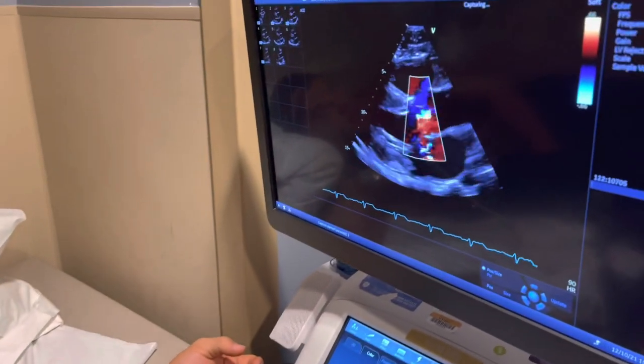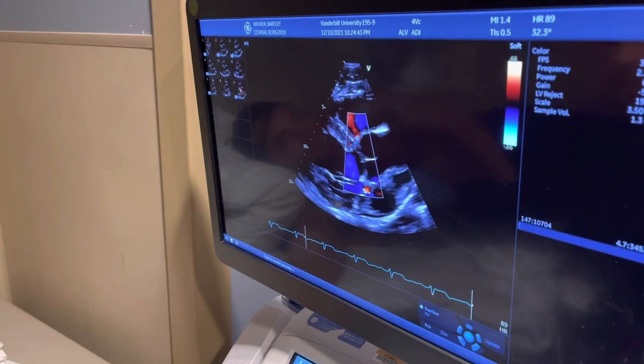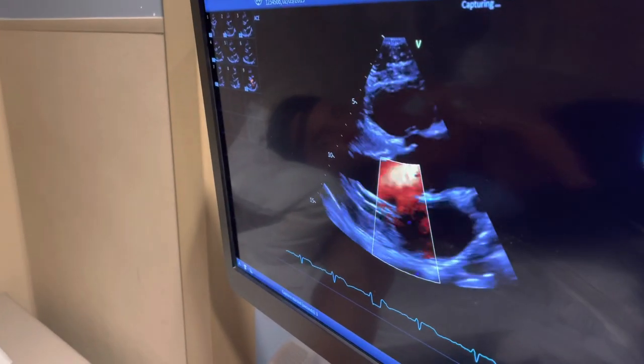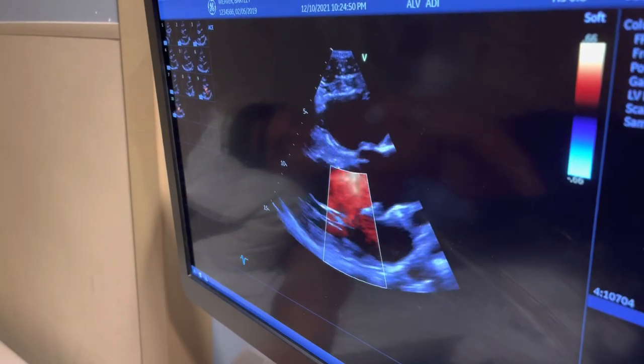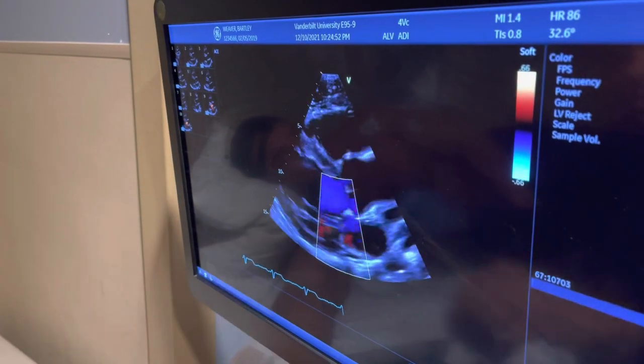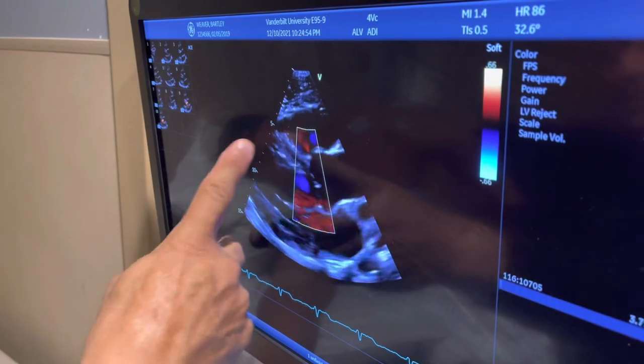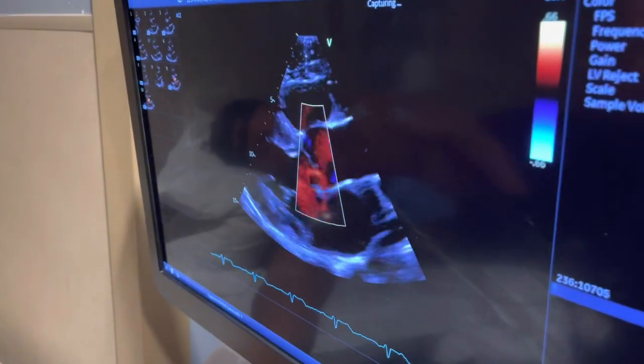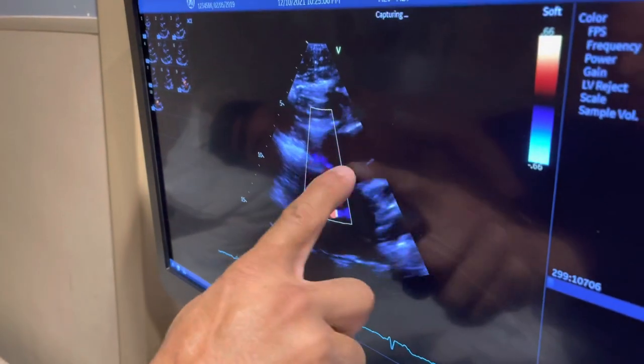All these colors show the direction of blood flow. This is a form of Doppler — color Doppler. We're looking at the flow from here to here, and every time the ventricle pumps, blood goes from here to here. Looks very, very normal. There's no regurgitation.